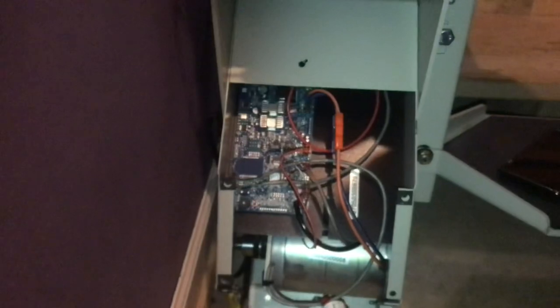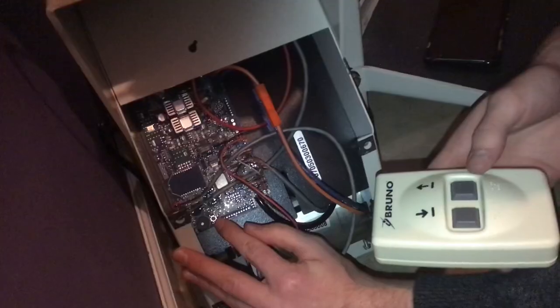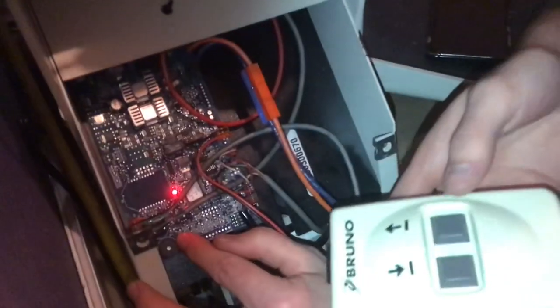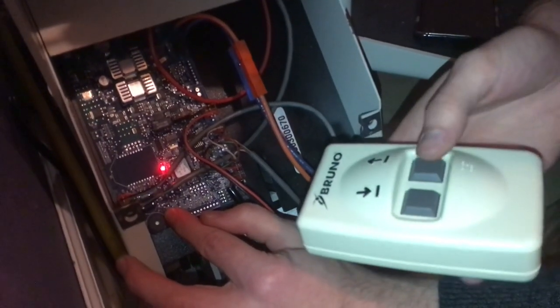We had to retrain the remotes. You push the button on the circuit board and the button on the remote. We did this procedure to one remote, and the other one followed suit. The dip switches inside the remotes are set the same.